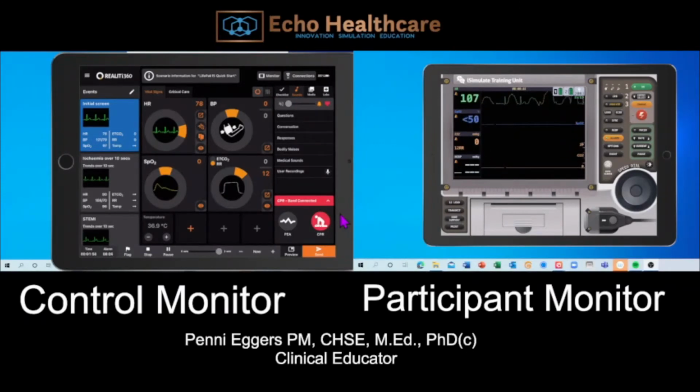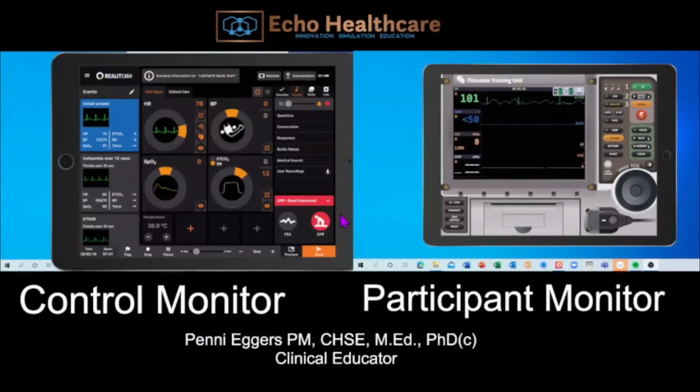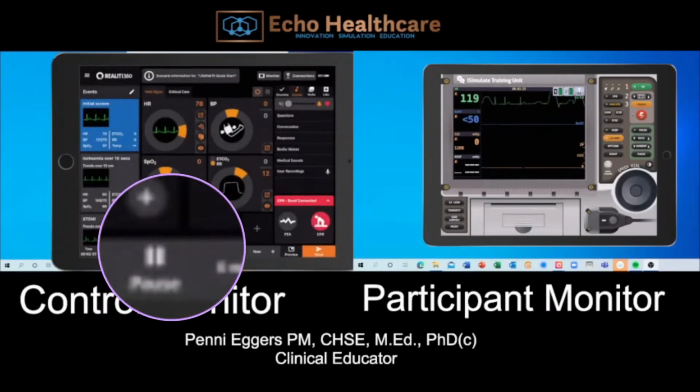And watch the monitor as I begin CPR. I'm doing CPR on my leg. You're going to see that the monitor changes to a CPR mode. I'm not doing very good CPR because you can see that I'm not getting good chest compressions, but I'm compressing my leg. But it does give me a rate. So I've now begun CPR, and let's stop CPR. And let's say that I want to flag that for poor performance. So I'm going to hit my flag button, which is right down in this location here. I'm going to flag it for poor performance because I don't think I did very good CPR.